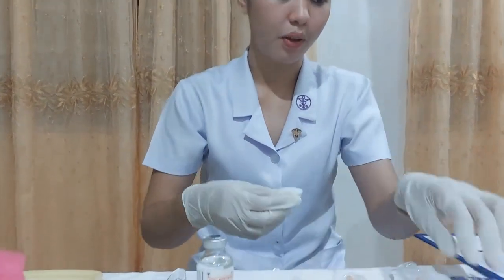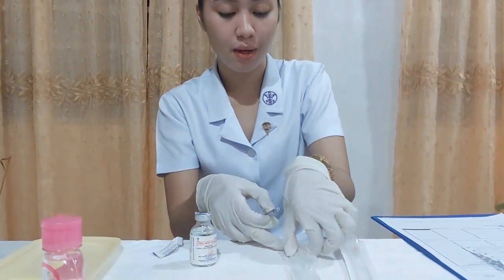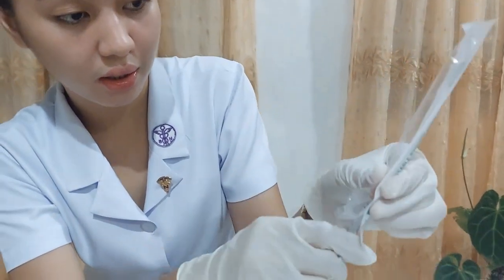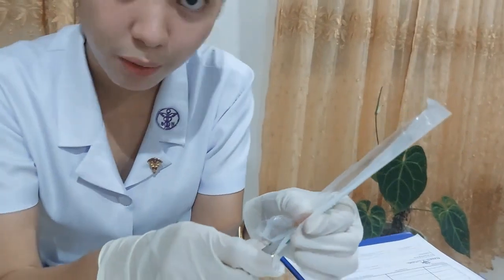Okay, I'm going to discard that into the proper receptacle. And now I'm going to prepare the syringe. I'm going to be attaching the filter needle onto the syringe so that we can proceed in withdrawing the medication. Okay, so we're just going to make sure, going to turn it. We have to ensure here that the filter needle is firmly attached to the syringe.